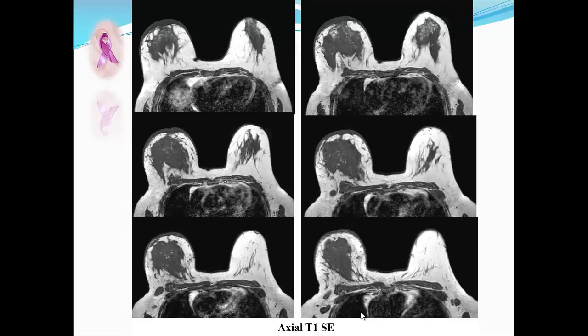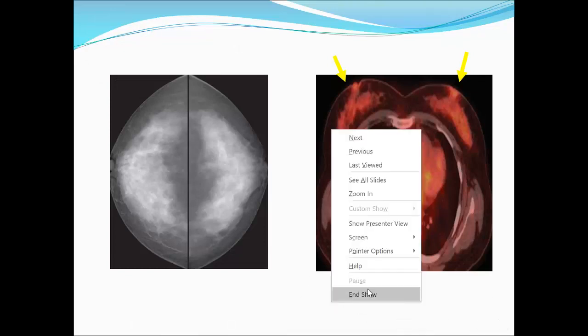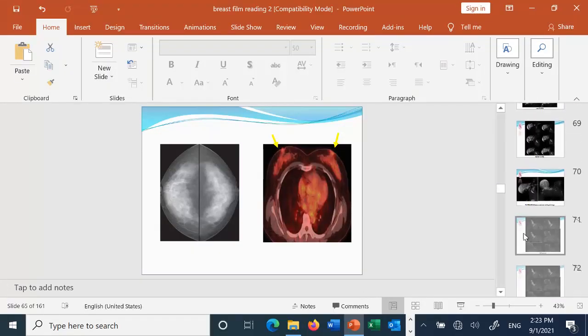This is an MRI. We will not go to the MRI of the breast in this lecture, because I want to be more basic.